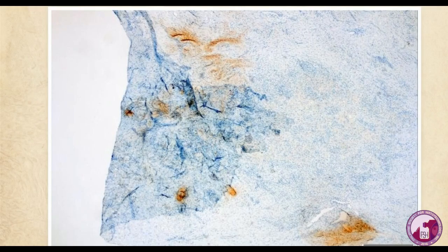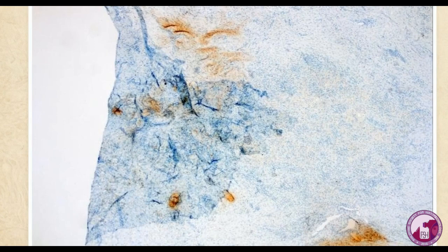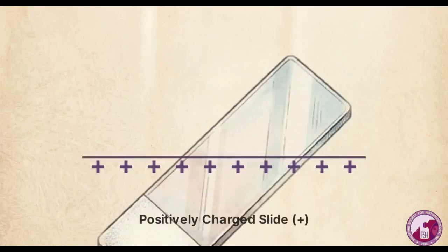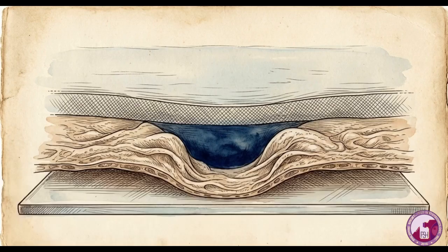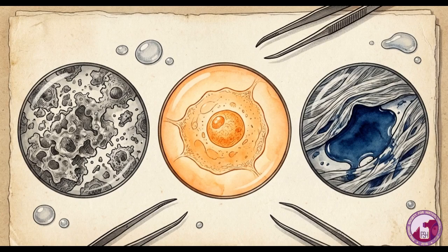The mechanical cause is entirely structural. Detection substrates become physically trapped underneath the tissue. Look at the irregular, hard borders here. Wrinkles, microscopic air bubbles, or water form physical pockets that grab and hold the substrate, creating a pool instead of the targeted stain. The prevention is mechanical. Utilize positively charged slides to flatten the tissue and force absolute adhesion. If the tissue adhesion is compromised, adding more wash steps will not clear the trapped reagents. When evaluating a noisy slide, look at the morphology of the stain first to determine if the tissue is decaying, reacting, or simply trapping liquid.